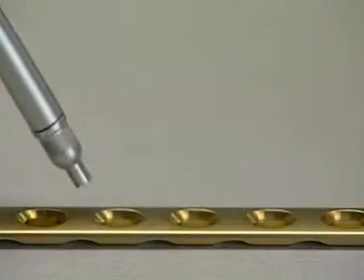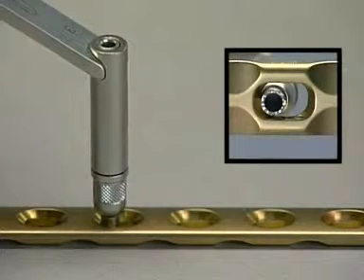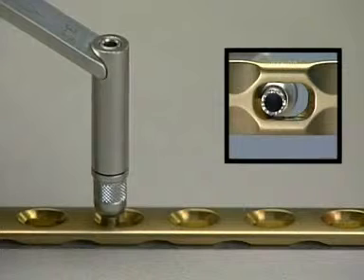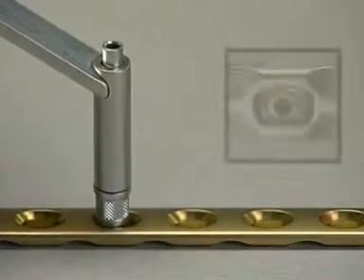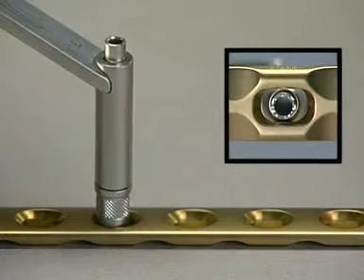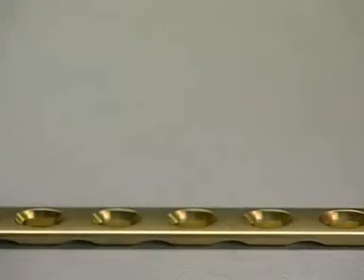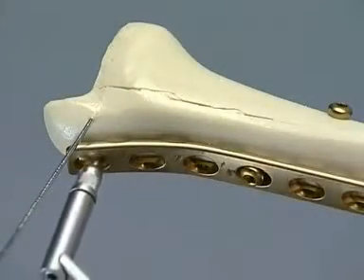The universal drill guide allows for eccentric placement of a screw when not depressed, and neutral placement of a screw when depressed. A cancellous screw will be inserted through the most distal plate hole.